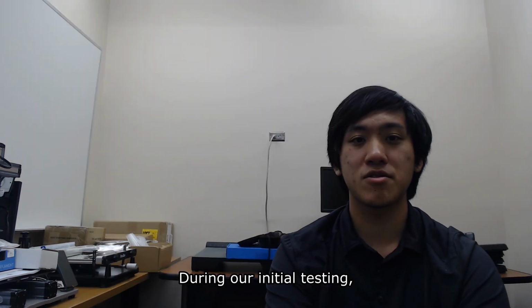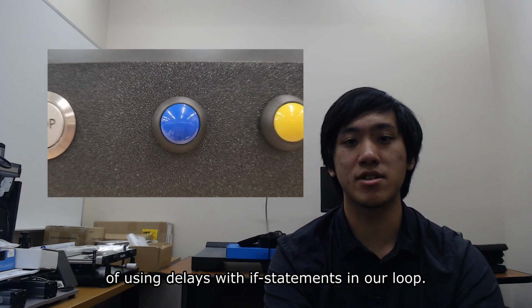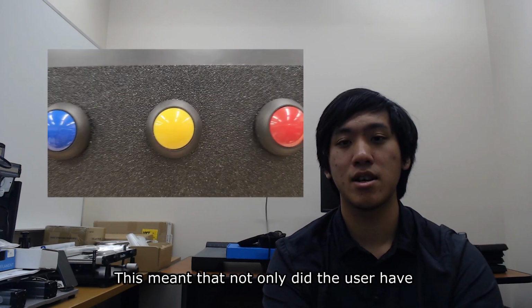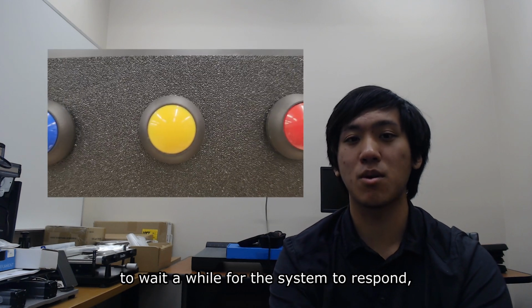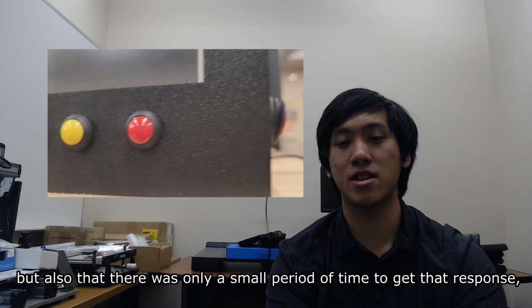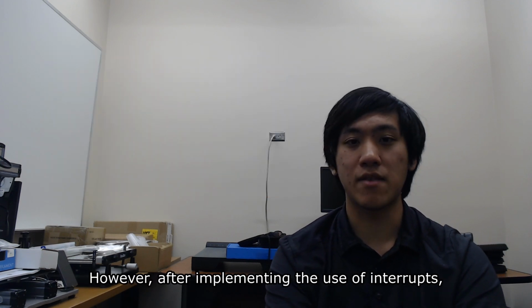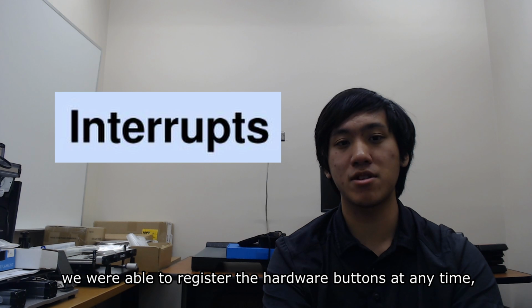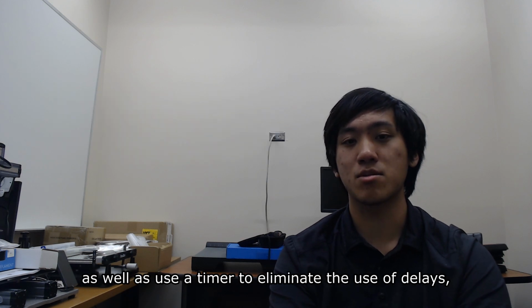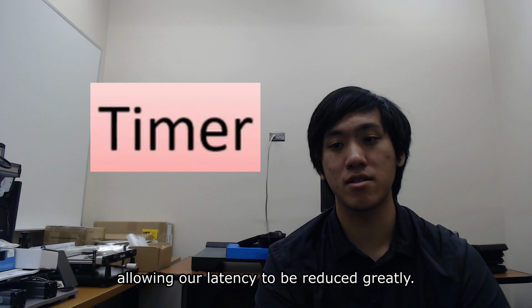During our initial testing, our buttons were slow to respond due to our rudimentary implementation of using delays with if statements in our loop. This meant that not only did the user have to wait a while for the system to respond, but also that there was only a small period of time to get that response, meaning sometimes buttons might not even register. However, after implementing the use of interrupts, we were able to register the hardware buttons at any time, as well as use a timer to eliminate the use of delays, allowing our latency to be reduced greatly.